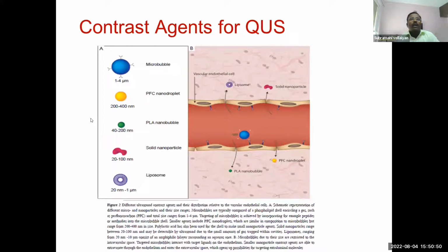And if you look at it, even radiomics. There are studies like ultrasound-based radiomics for therapy response monitoring. In locally advanced breast cancer, multicentric studies have also started taking place. So this shows the potential. Not only that, photoacoustic imaging is one of the very burgeoning research areas in the developed countries. You can see that ultrasound is able to be taken to the LINAC. You will be able to image microscopic, macroscopic as well as vascular, and use it pre-treatment, during treatment, and post-treatment to understand the treatment response.